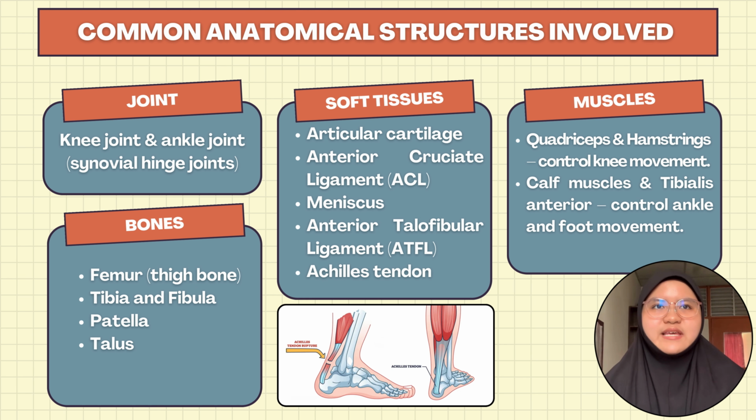Bracing supports these anatomical structures by reducing mechanical strain, improving alignment, and preventing excessive or harmful movements, ultimately protecting the joint and surrounding soft tissues during both movement and recovery. Understanding these anatomical structures helps us to appreciate how leg braces not only support healing but also help maintain functional mobility in daily life and rehabilitation.